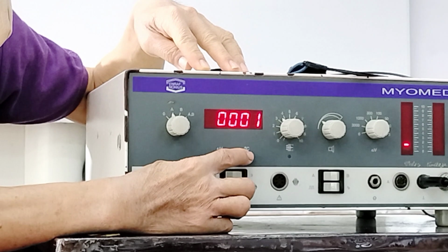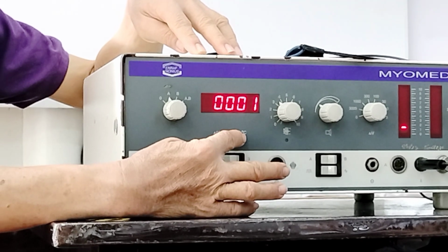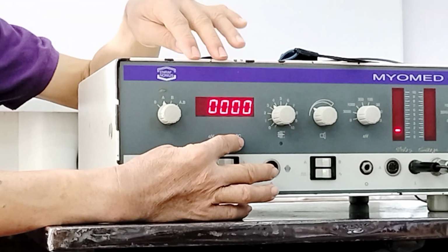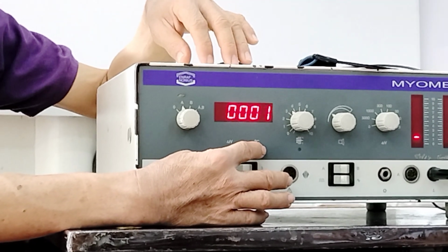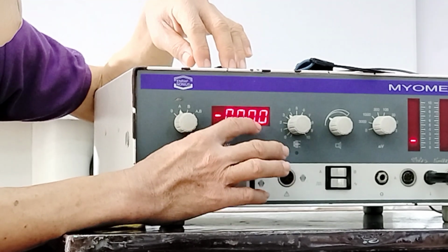If on the other side, degrees Celsius lights up and the other turns off, that would indicate that the machine is now getting signals from temperature, degrees Celsius or centigrade. Whatever value appears, that is the unit.